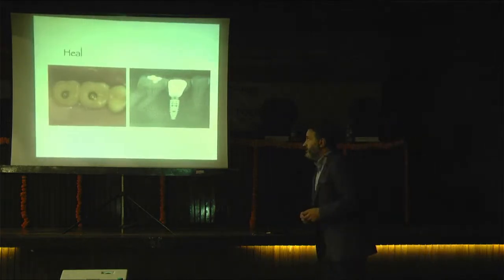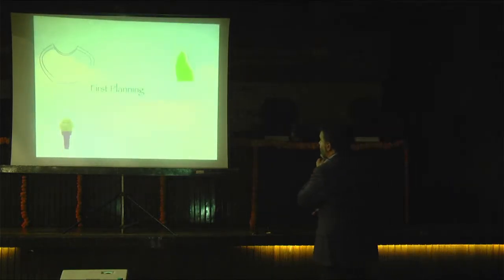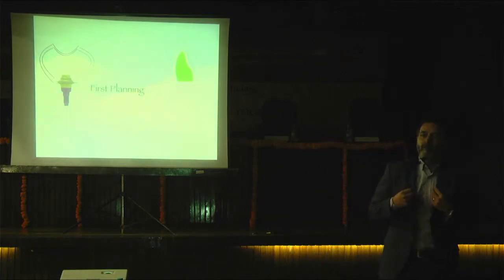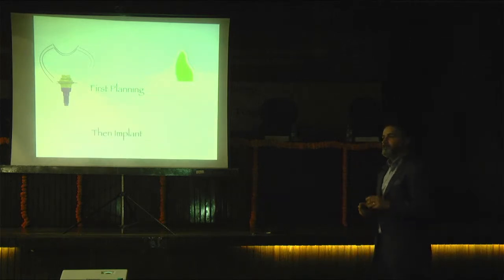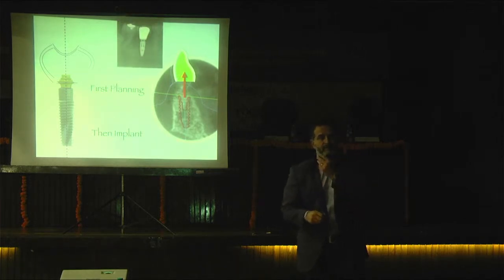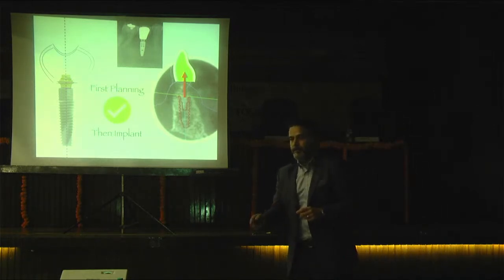So what do we need? We need healthy implants and healthy crowns at the same time. So we need a little bit of guided surgery. When we learn to think prosthetic driven, and when we make the planning first, we have the chance to give the best option to the patient. Why? Because we can place the implant in the right way, in the right angulation, and in the right place.